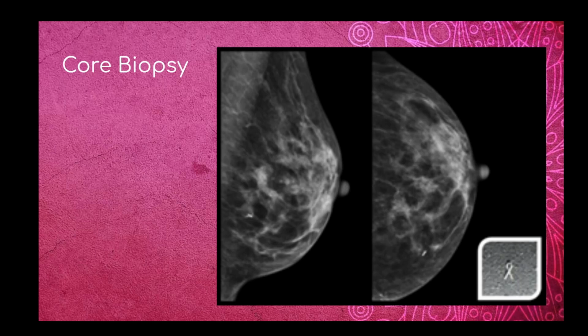These are much better at diagnosing lesions just because you get more tissue, you get a little bit of the surrounding tissue, so now you can differentiate between healthy and cancerous tissue a little bit better.